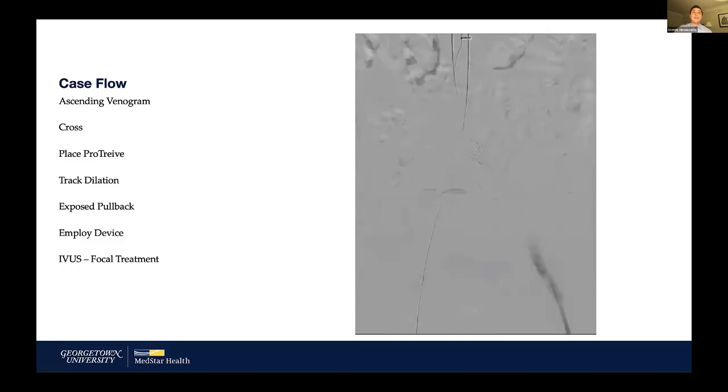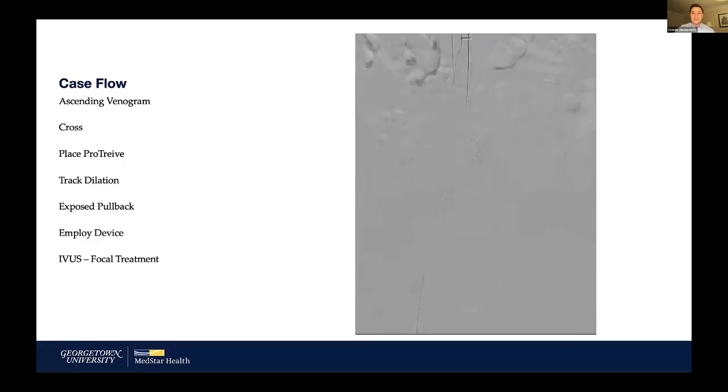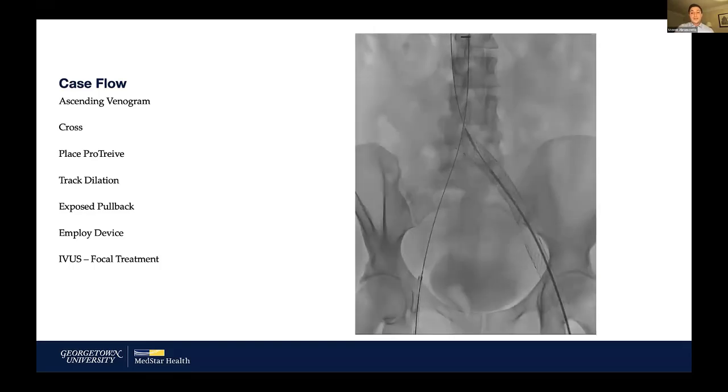One challenge is that we don't know for certain what constitutes a significant stenosis in terms of thrombus relining these stents. In doing the RevCore case, it was go for gold — we had a tool available and continuing to work on that material was in the best interest of maintaining patency. I continued to rev, working a couple rotations clockwise, then counterclockwise, and attempting a flip-up to work on material stuck on the end of the stent.